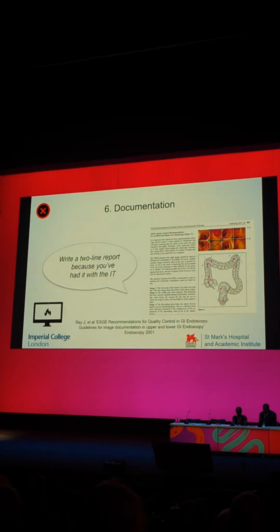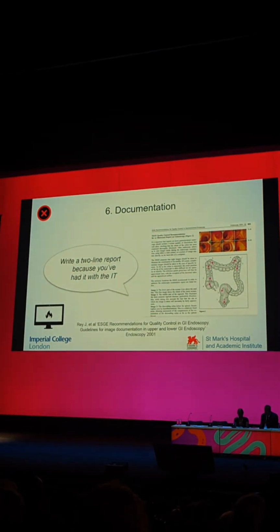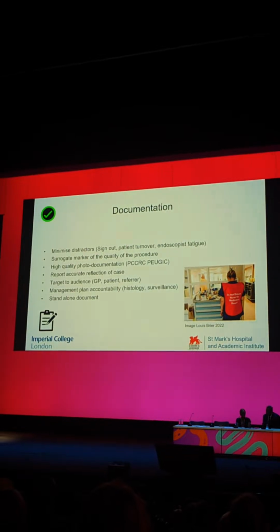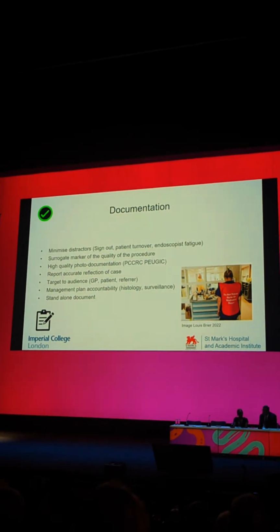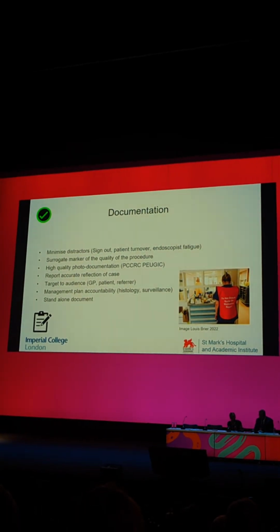We have this published, we know we should make sure we take views, particularly flexures or areas where we might miss pathology. But actually, I think there's not enough focus on how you standardise and improve the quality of your documentation. And just like we have nurses who are doing drug rounds who have these bibs that say do not disturb, I think the time of report writing is a particularly busy time in the endoscopy unit where you need to make a concerted effort to minimise those distractions.